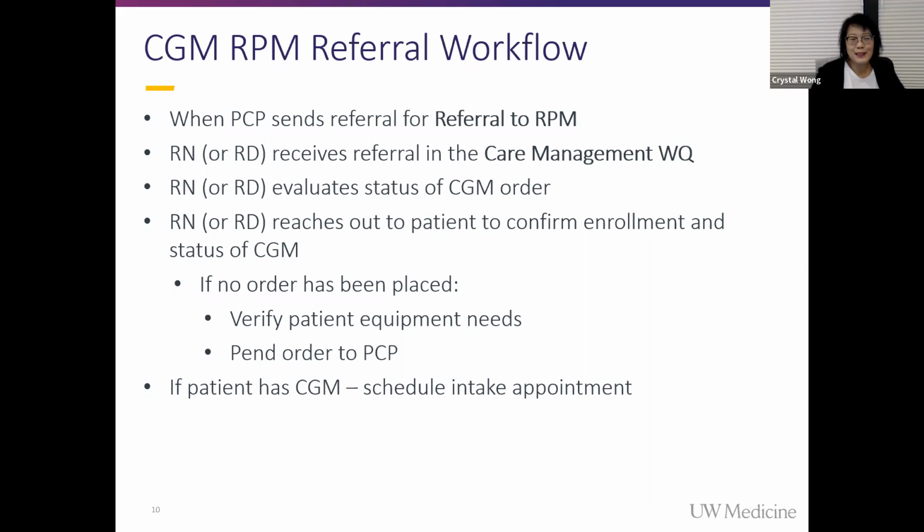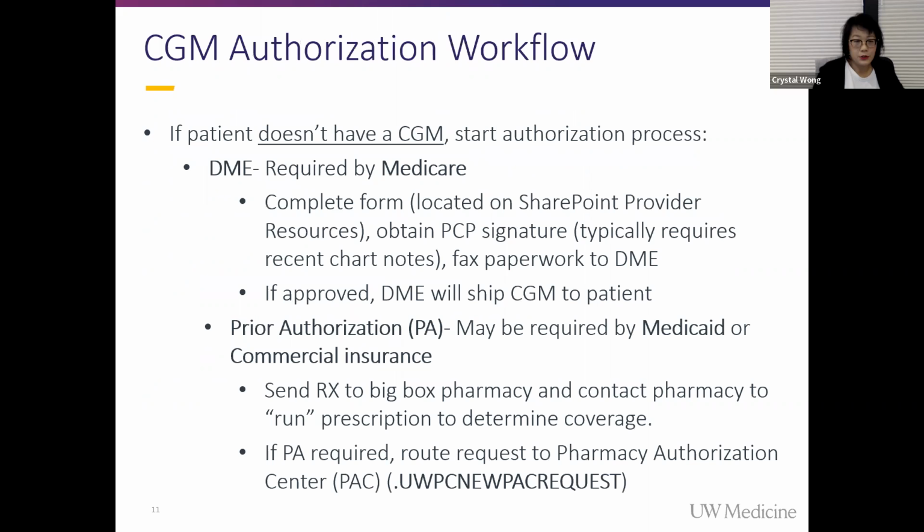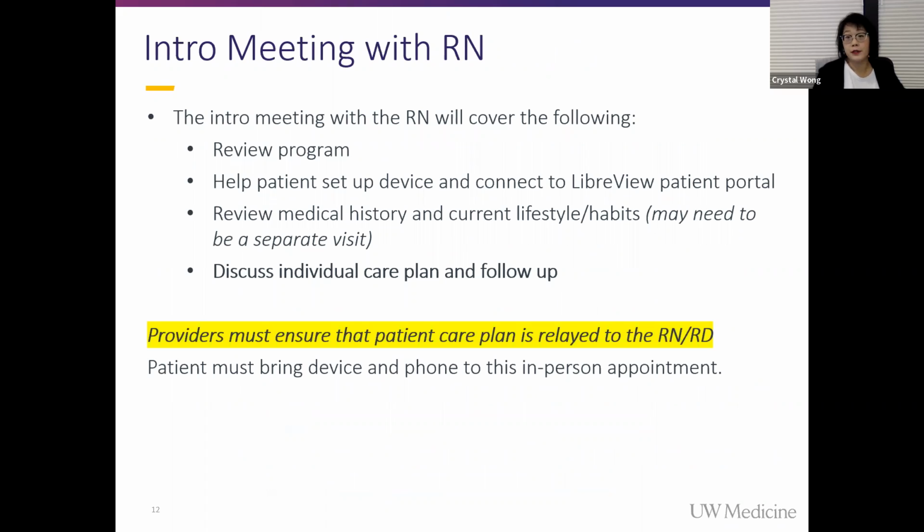And then if all the boxes are ticked, they're going to go ahead and schedule the intake appointment, in which they will do a couple things. One is teach the patient how to use the device, as well as do some lifestyle history taking, and some coaching. So this is just some details about what's going to go on if they need the prior auth. I'm not going to go through this, but this is all fleshed out with the prior authorization team. That was not support that we had during the pilot, so I know all the RNs and RDs are happy that we have that added in real life now.